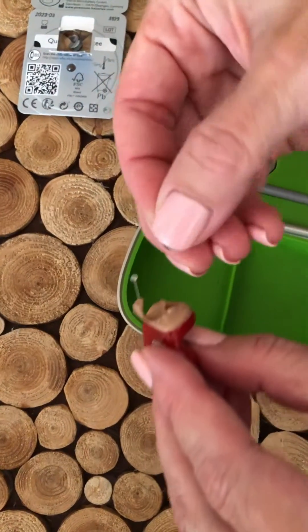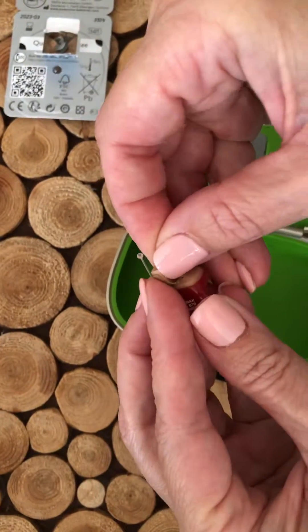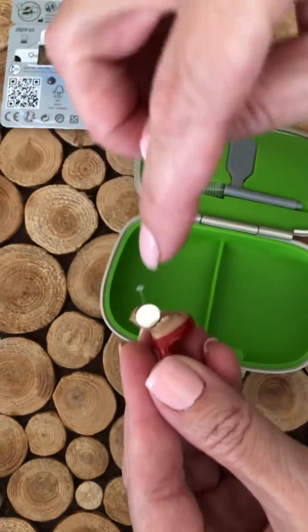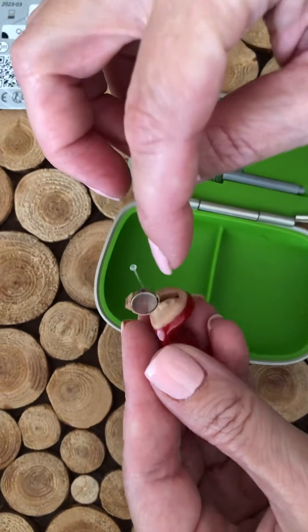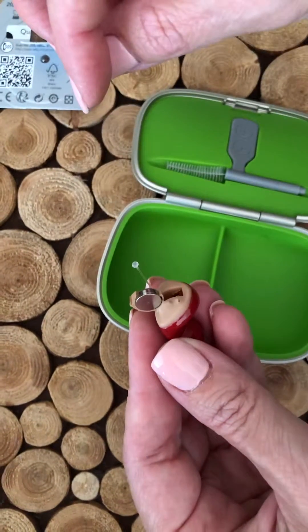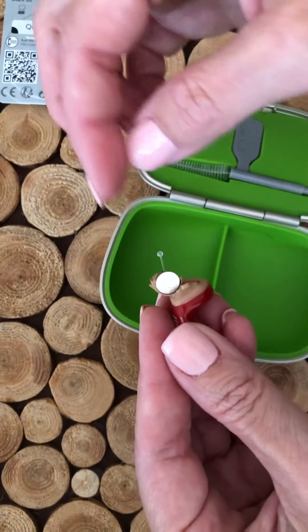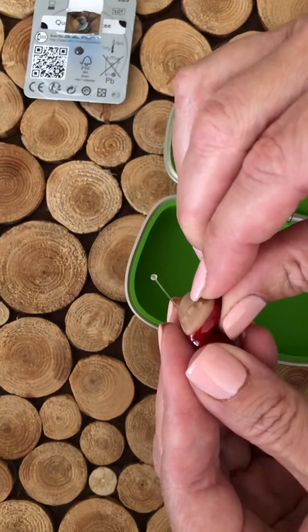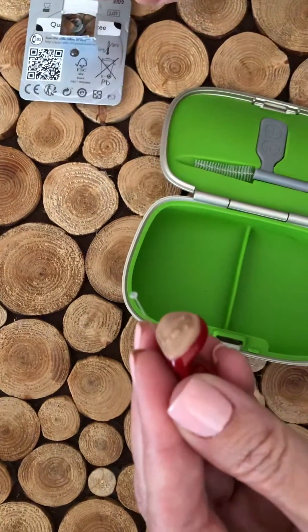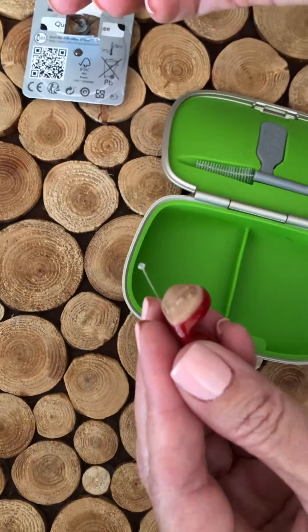Grab the hearing aid and just insert the battery in the door. Hearing aid batteries always go in the door — do not jam it inside the actual hearing aid; I've seen people do that. The flat side is up, the ridge side is at the bottom, and you close the door and the hearing aid is turned on. And that's how you insert the battery.